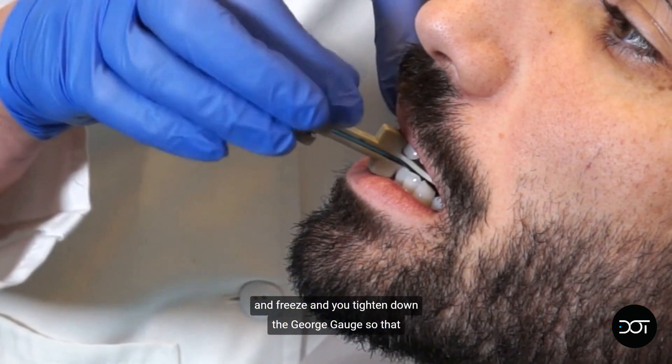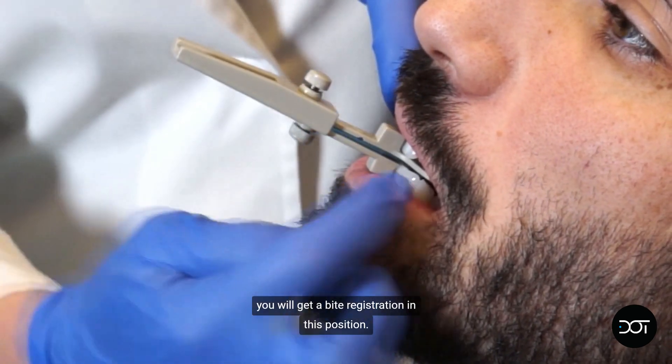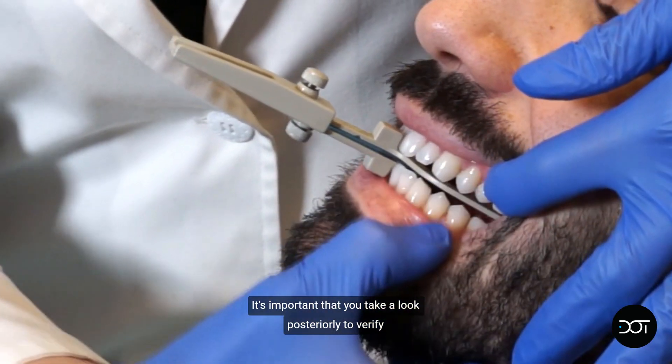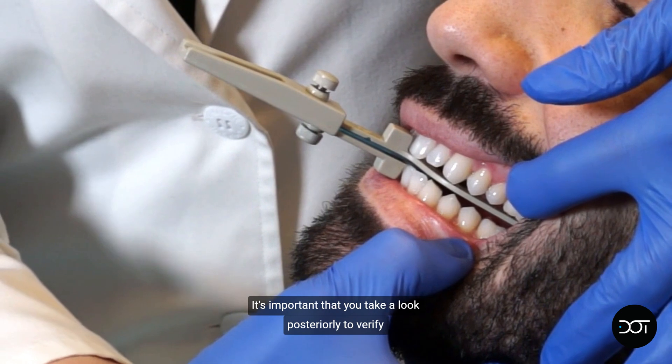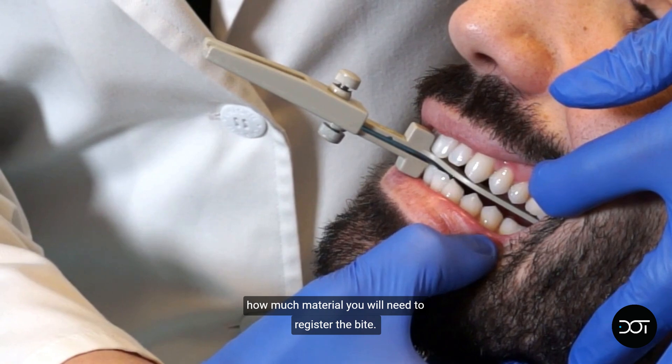Tighten down the George gauge so that you will get a bite registration in this position. It's important that you take a look posteriorly to verify how much material you will need to register the bite.